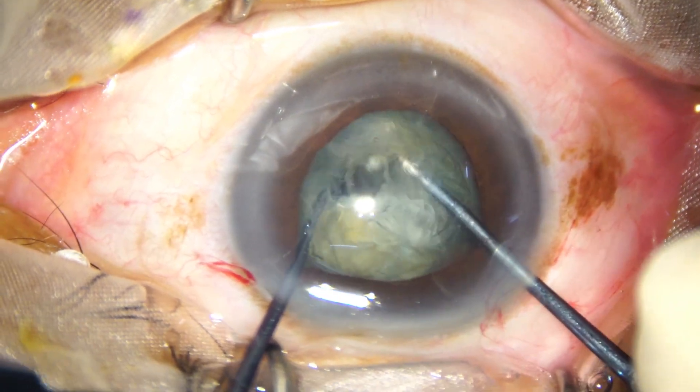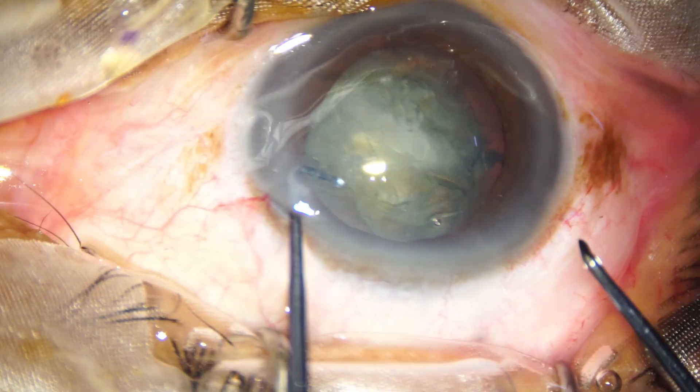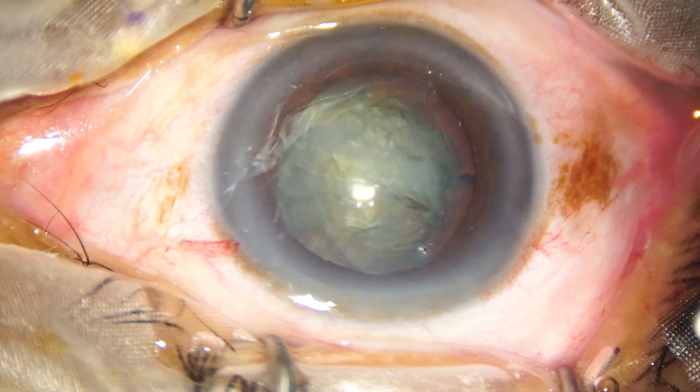Counter force is applied by the nucleus manipulator. So, we have divided the nucleus into two halves.